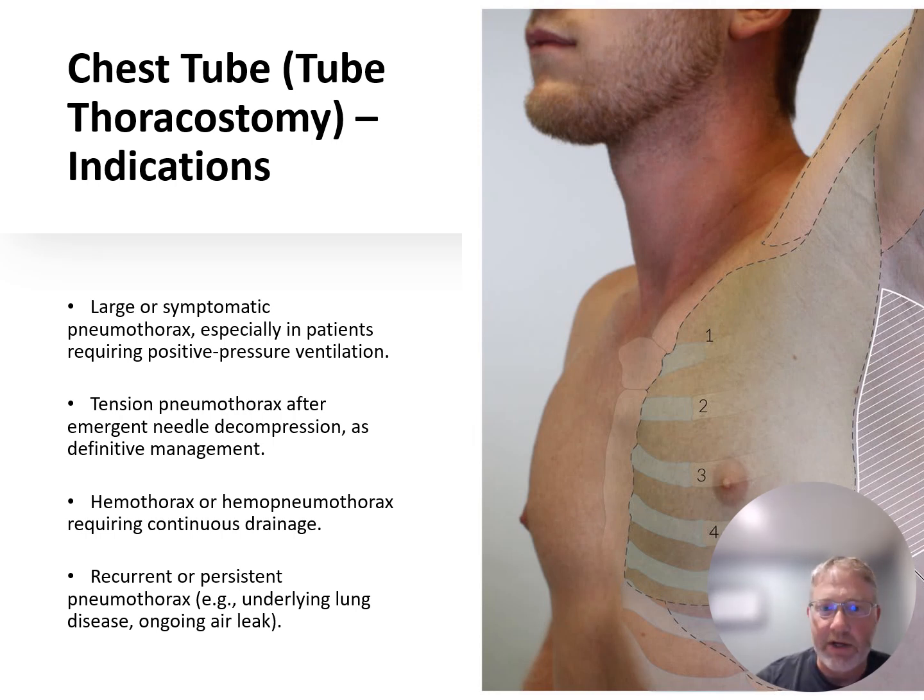And then finally, recurrent or persistent pneumothoraces, particularly in patients with underlying COPD or interstitial lung disease, often require tube thoracostomy for definitive management, no matter what.